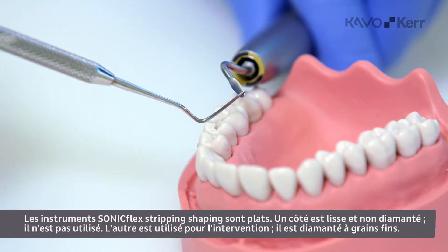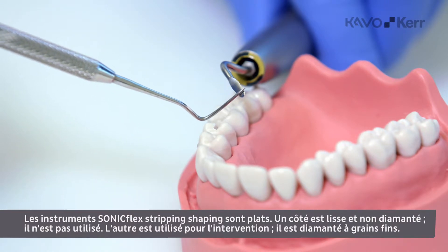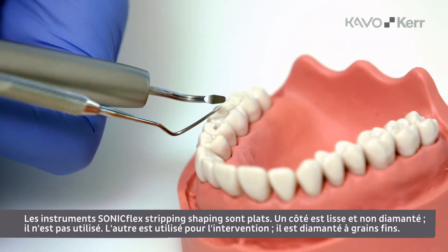The SONICflex stripping shaping instruments are flat with a non-working surface without a diamond coating and a working surface with a fine-gritted diamond coating.